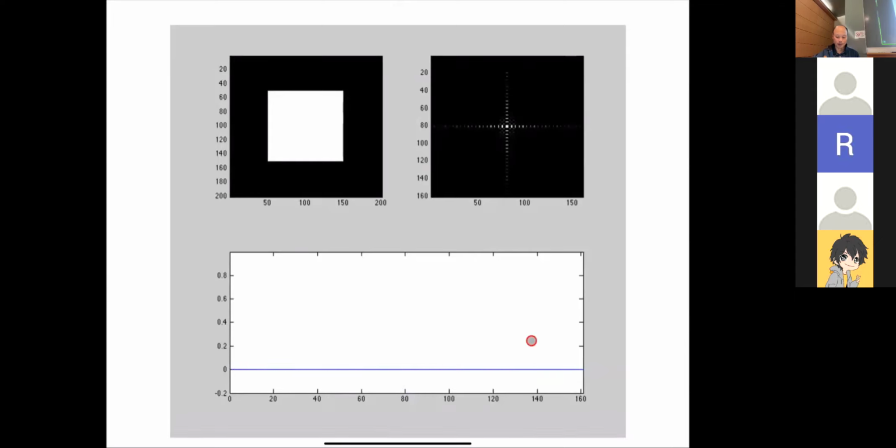This is the signal that would be coming into your receiver, and as it comes in, you store it in this array, and at the end you do the inverse transform and get back to your object. Question? Since the pattern is so uniform, I feel like we would expect it to have just one peak. Remember, this is a rect function, right? And a rect goes to a sinc. Anytime you have sharp edges, you need lots of frequencies to represent a sharp edge.